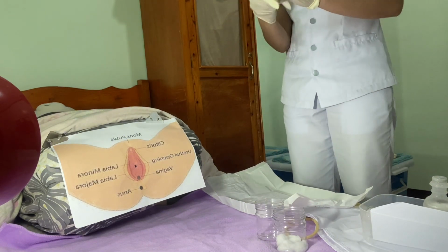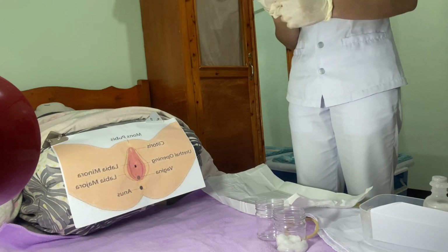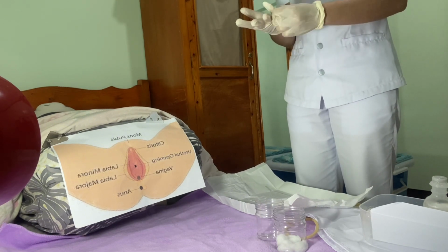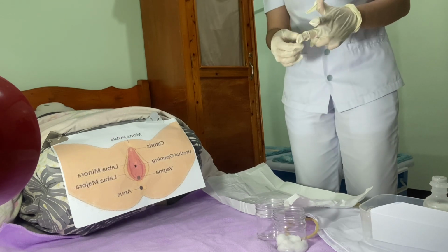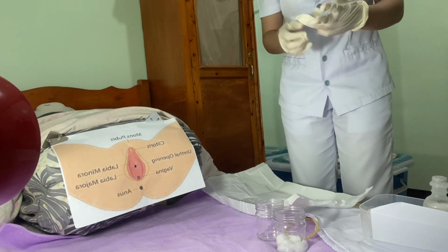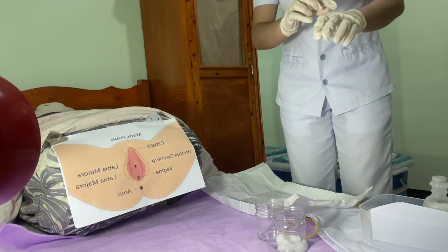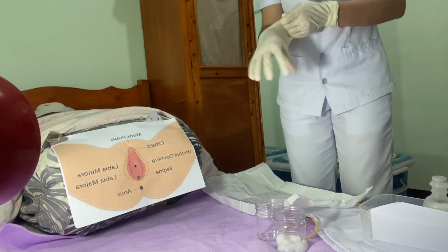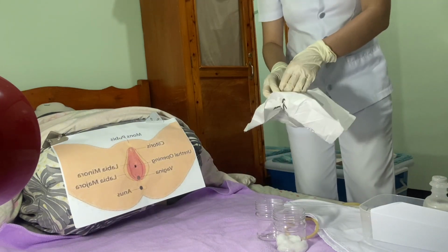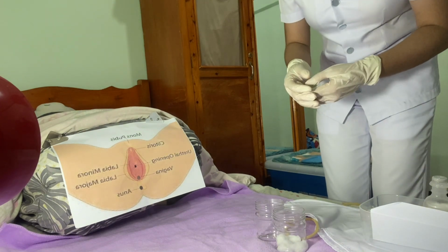Okay, so we're gonna fix this one so it will properly fit our hand. Okay, so we're gonna touch the sterile object and throw this one. So now we're gonna put the eye sheet.